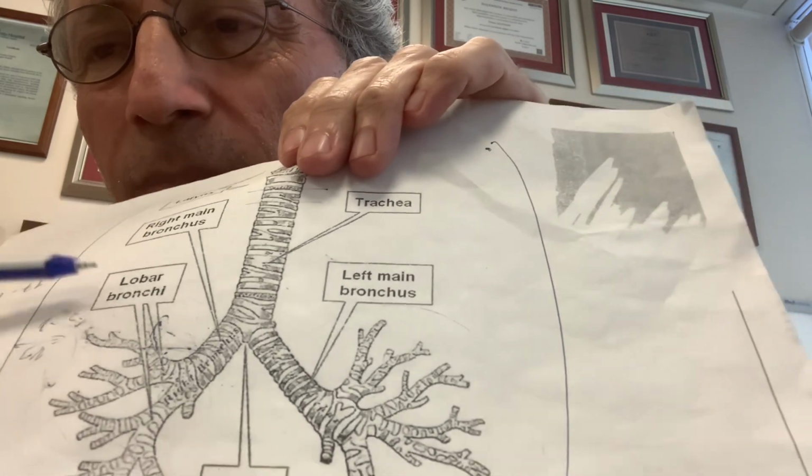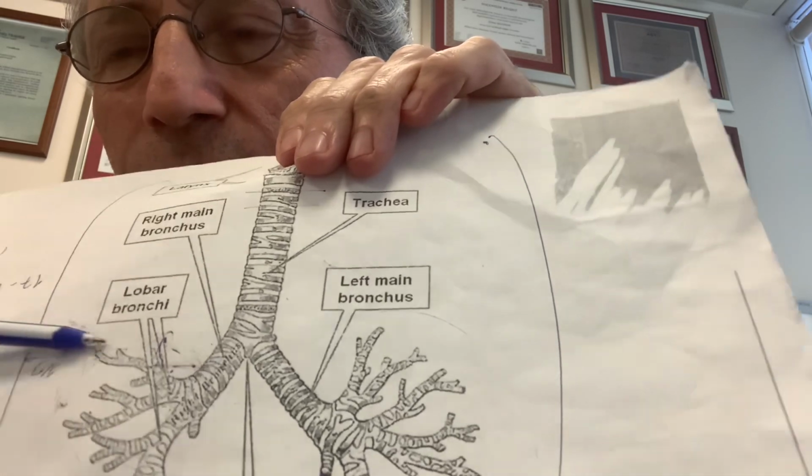A thinner bronchoscope is then used, as a second stage, to reach the very ends of the bronchi, where the alveoli, air sacs, are located, to ensure the air passages are completely open.